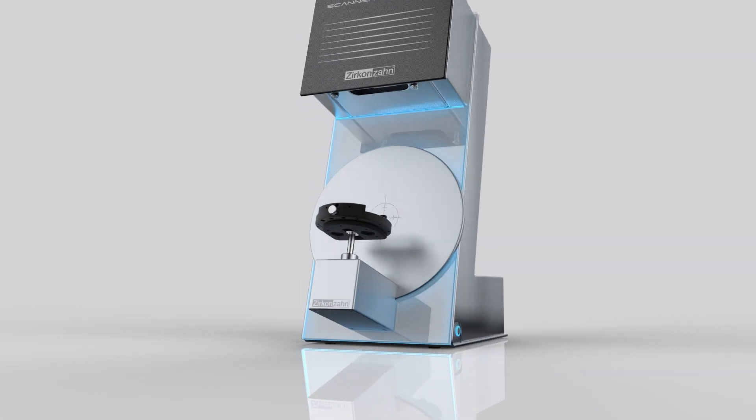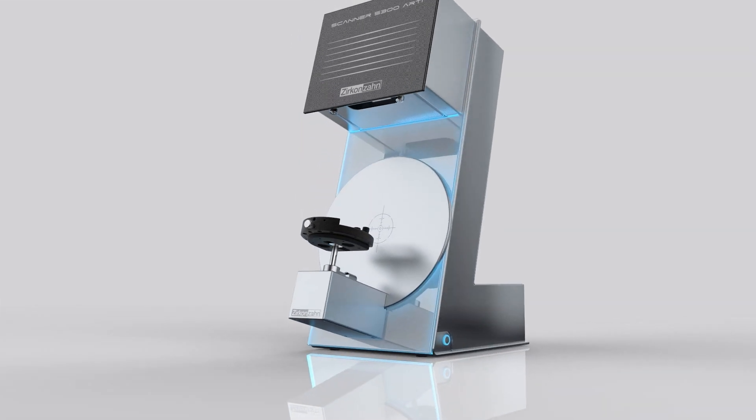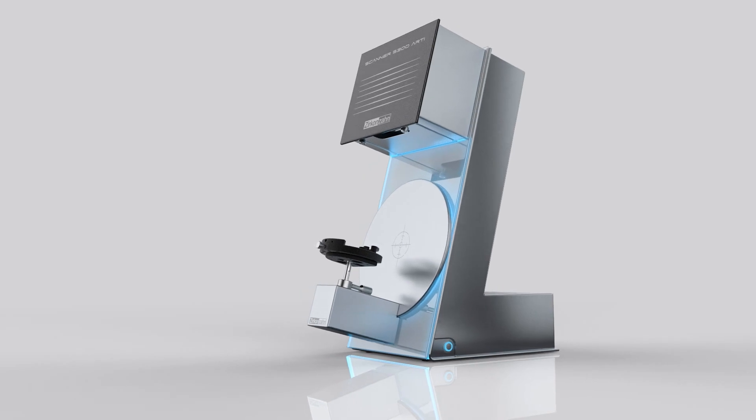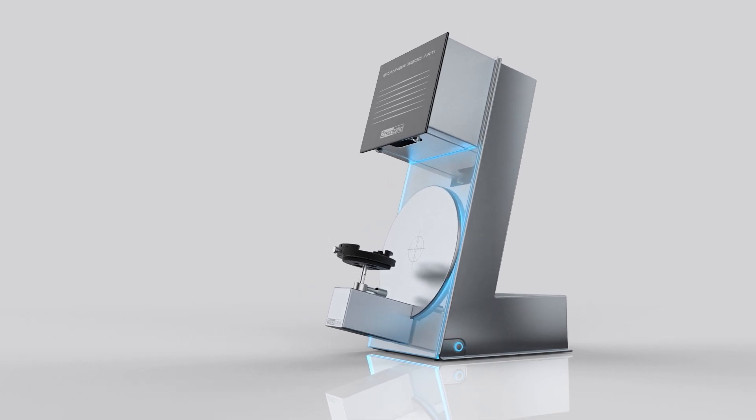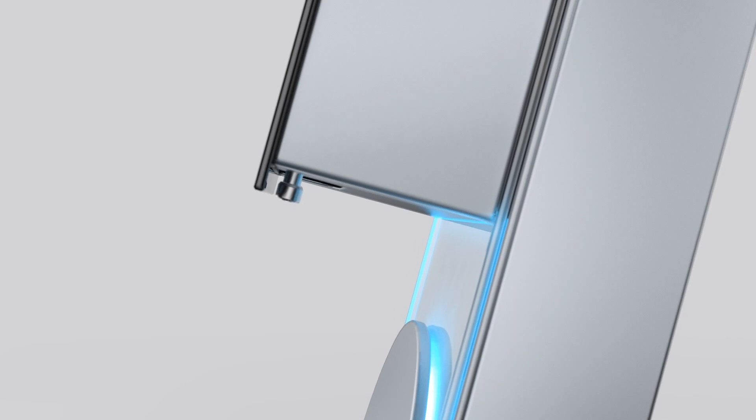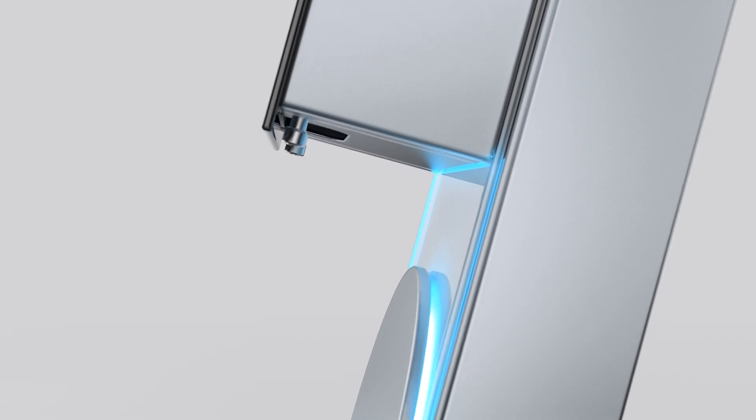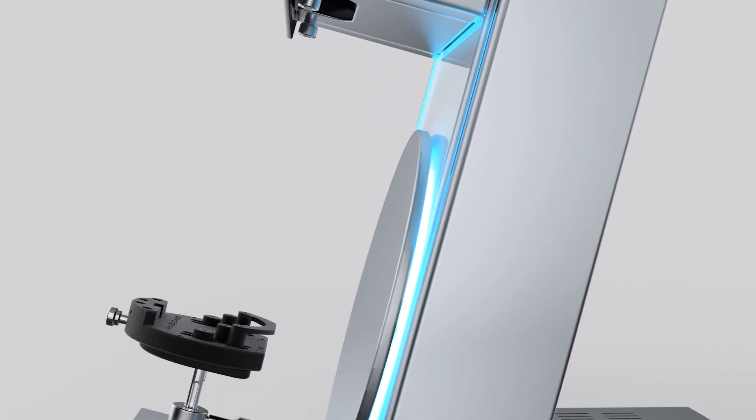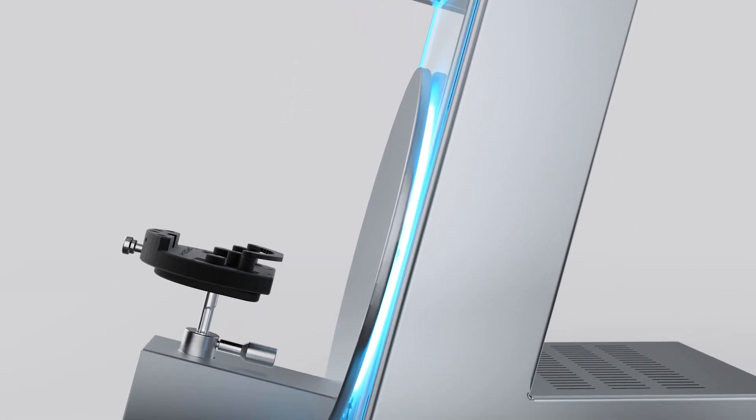The S300 ARTI is a fully automated optical structured light scanner, ideal for scanning models and articulators. Elegant and innovative, this scanner stands out for its compact lightweight design.